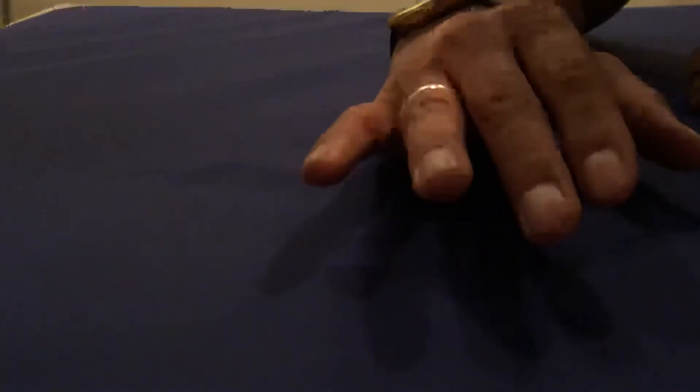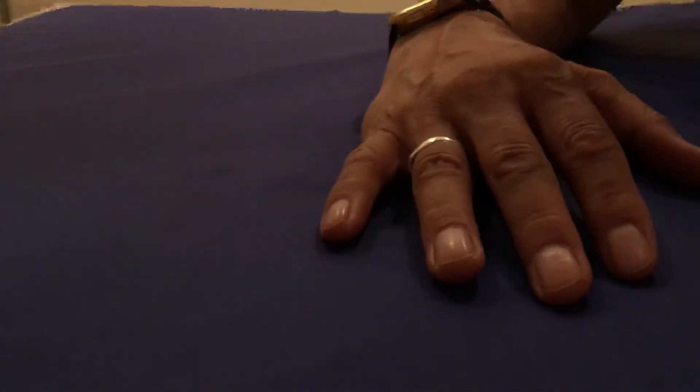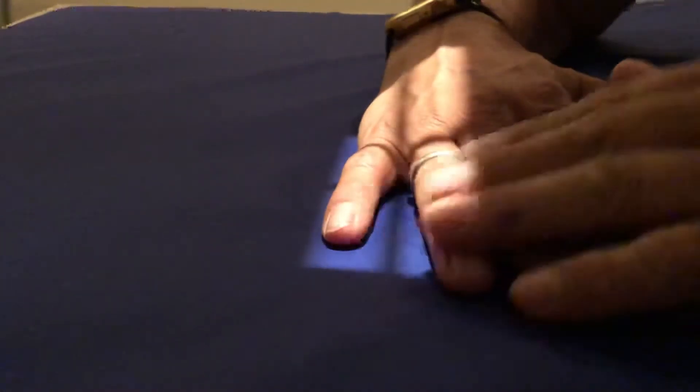The fourth one is going to be the lateral, and the way you do the lateral is you flex the other fingers, bring them all in, except for the small one, and that's how you would shoot it.